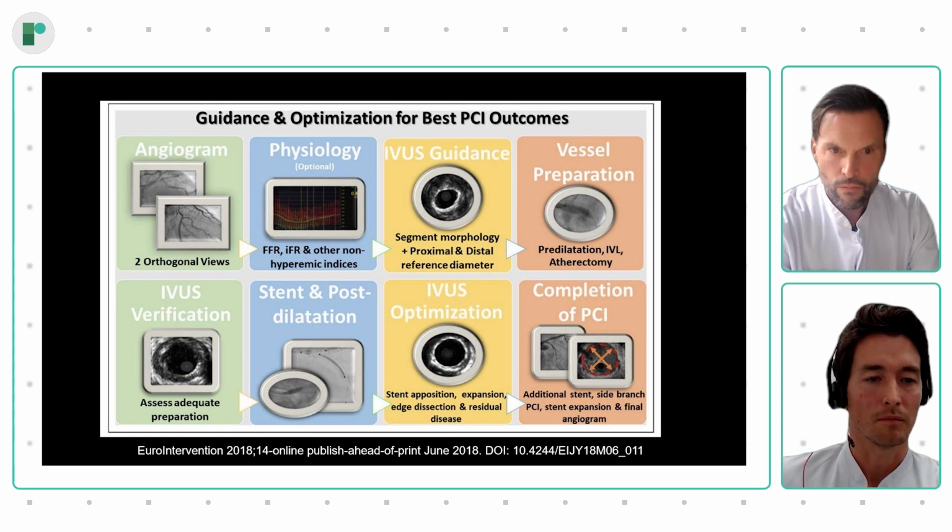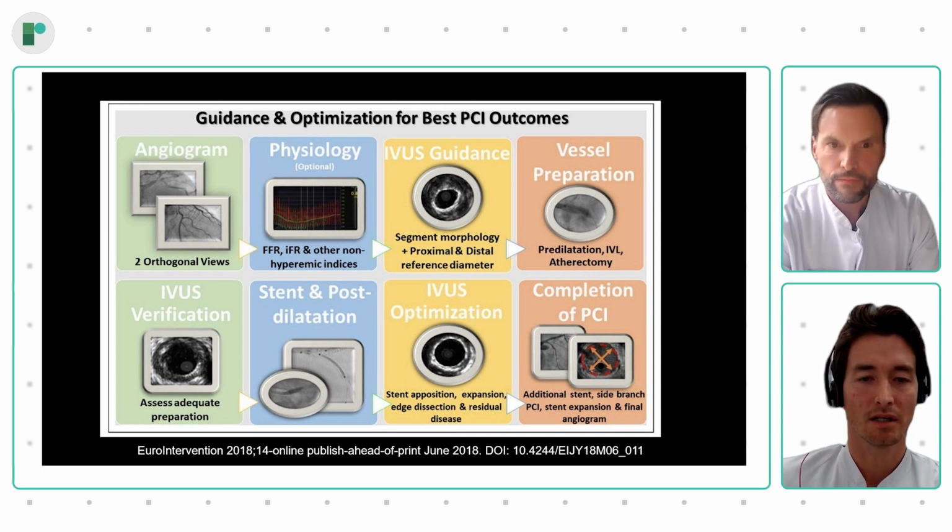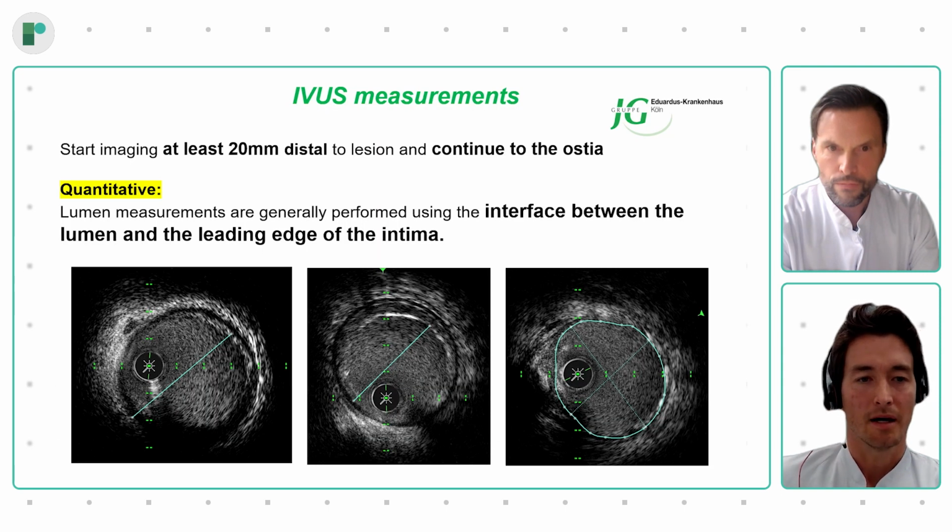After the verification by IVUS, you then proceed to stenting and post-dilatation, and very importantly, you shouldn't be satisfied with your angiography. You should always consider the IVUS optimization, because you will be surprised by many findings that you wouldn't have foreseen, only judged by the angiography.